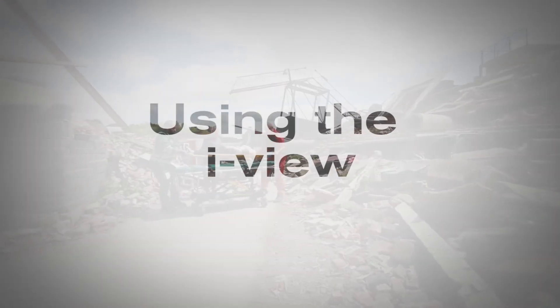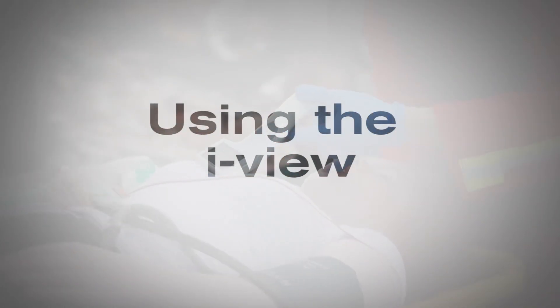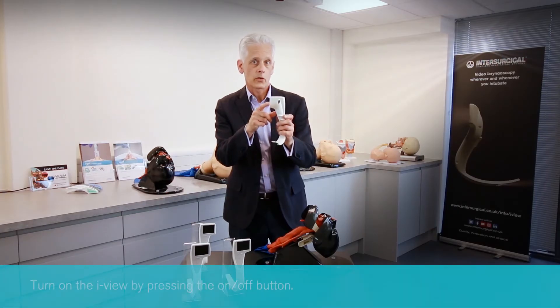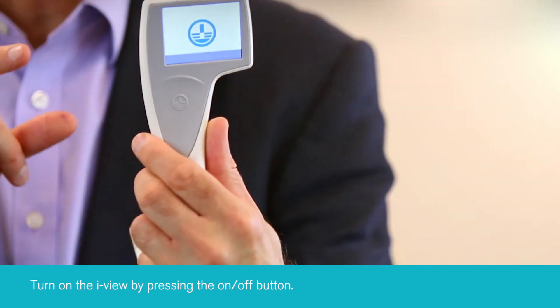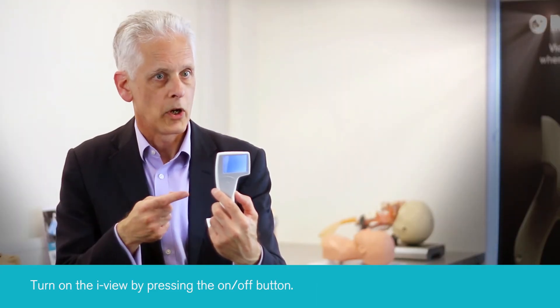I'm now going to show you how to use the device. You turn it on by simply depressing the on/off switch at the back of the device. After a couple of seconds you get the InterSurgical screen and then it will be operational.